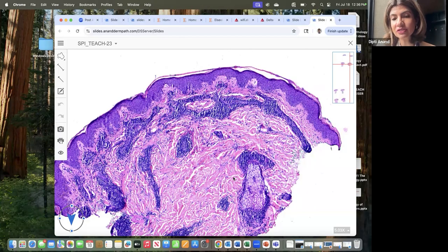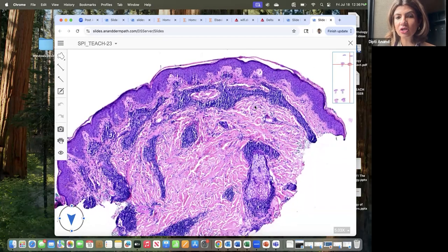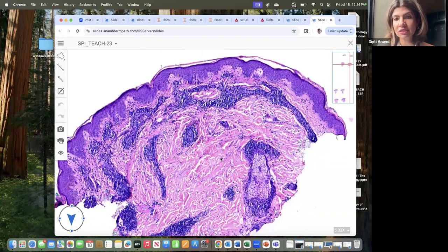So this is a lymphocytic infiltrate, which is superficial and deep, with dermal edema and some spongiosis, which is consistent with PMLE. Okay, so this is also a really important slide. When you see a superficial and deep lymphocytic infiltrate with no eosinophils, with epidermal spongiosis and dermal edema, we're again dealing with something light related. So this is PMLE. That's the hot and the cold phenomenon. Both Pernio and PMLE will produce a lymphocytic infiltrate around vessels with dermal edema.